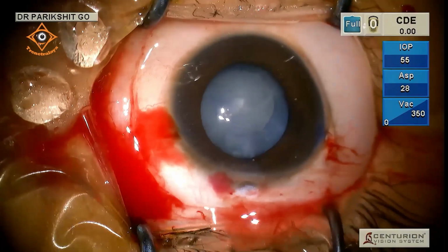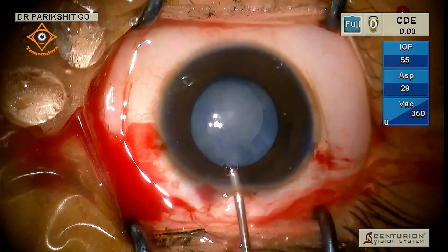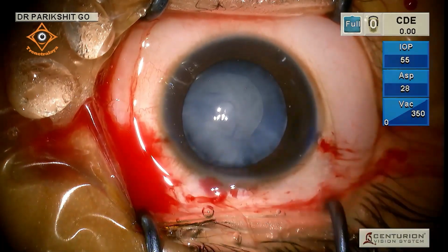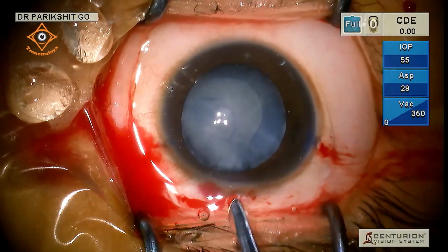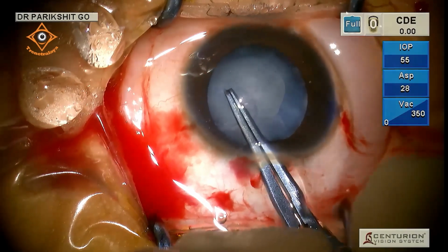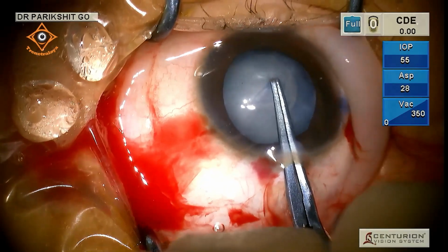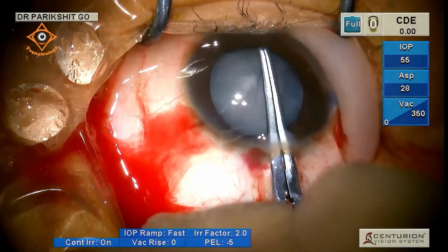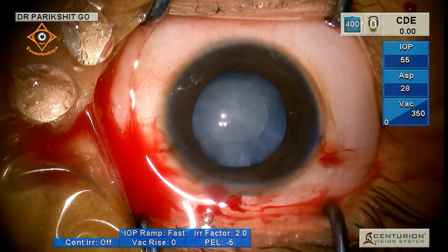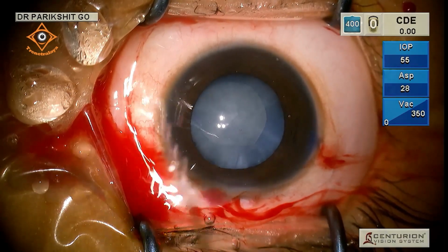In this case also, it is like that. So we will not ask the person to stop till he completes the rexis, because it is not a simple case. It is a case where the lens is swollen and intralenticular pressure is high, although he has put adequate viscoelastic. I have seen Jagat Ram sir's video of the CCC being done like a protractor. I think excellent job. You have completed it. Yeah, we appreciate you.